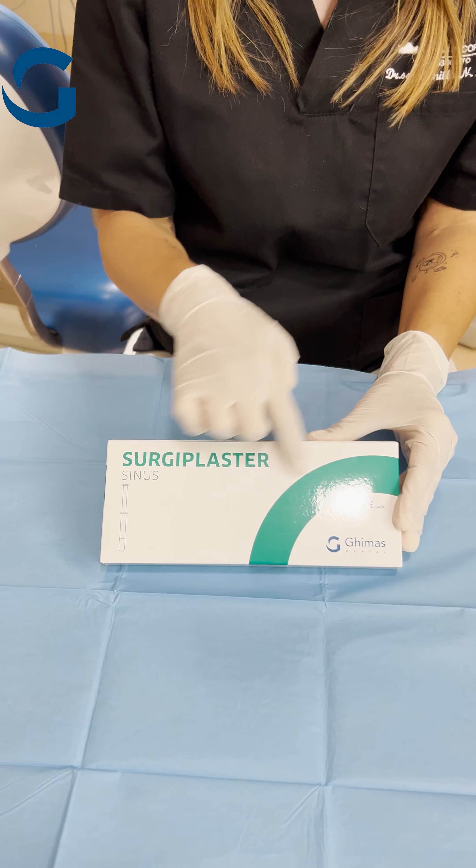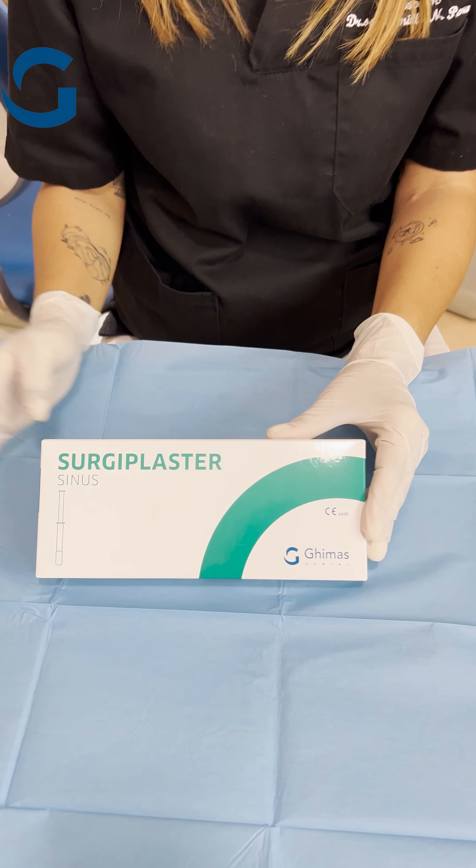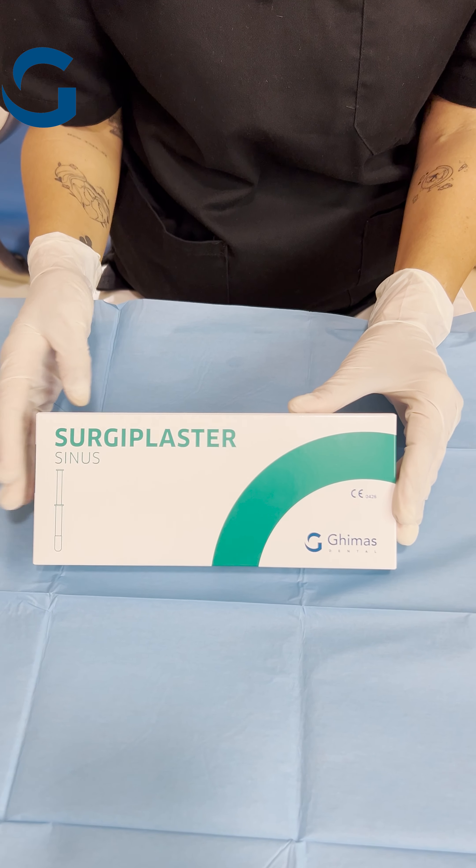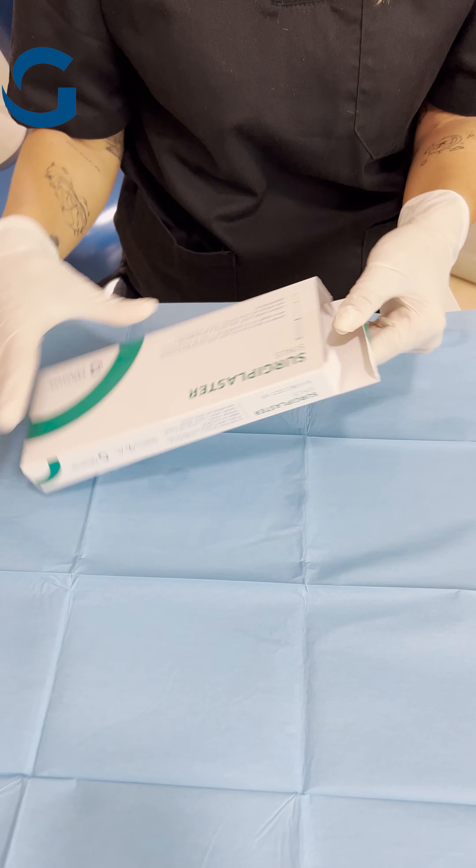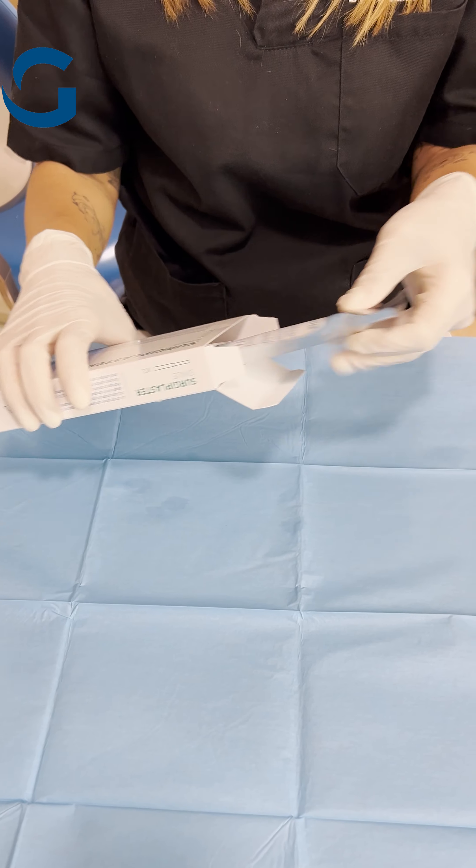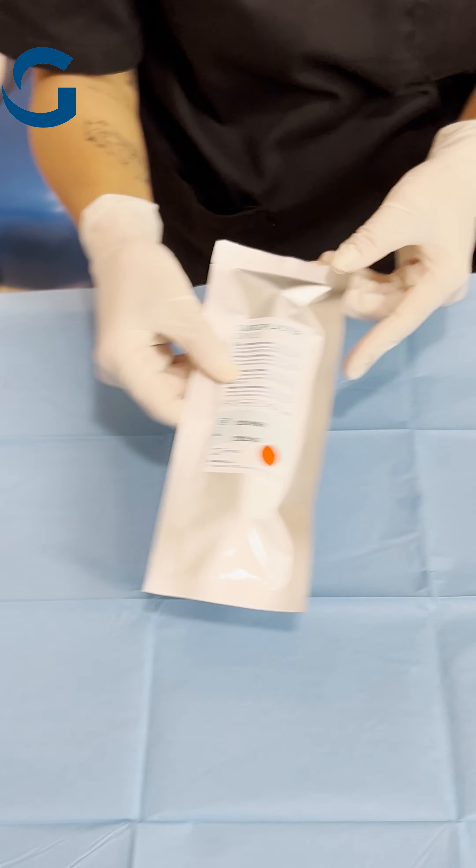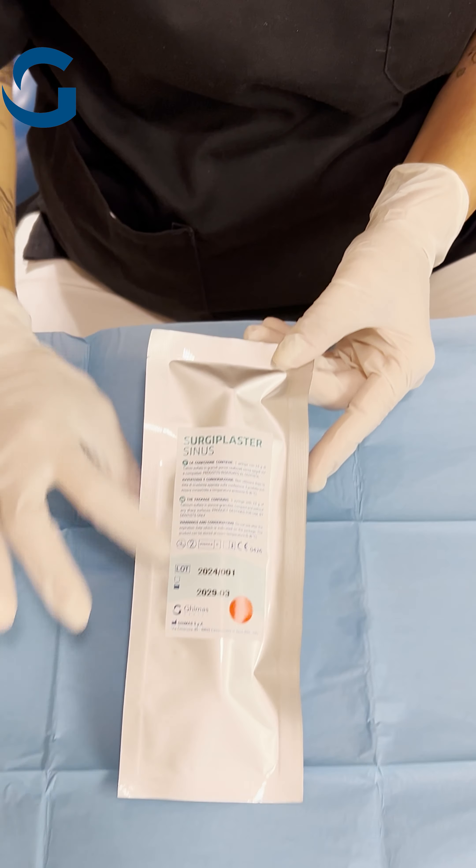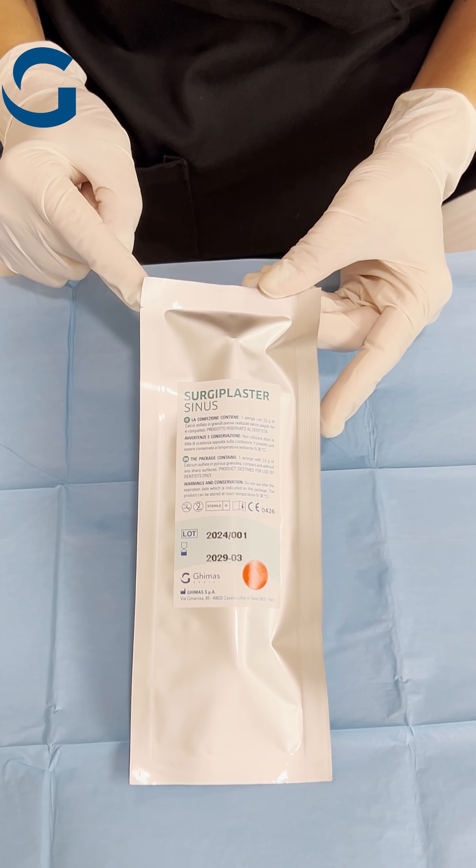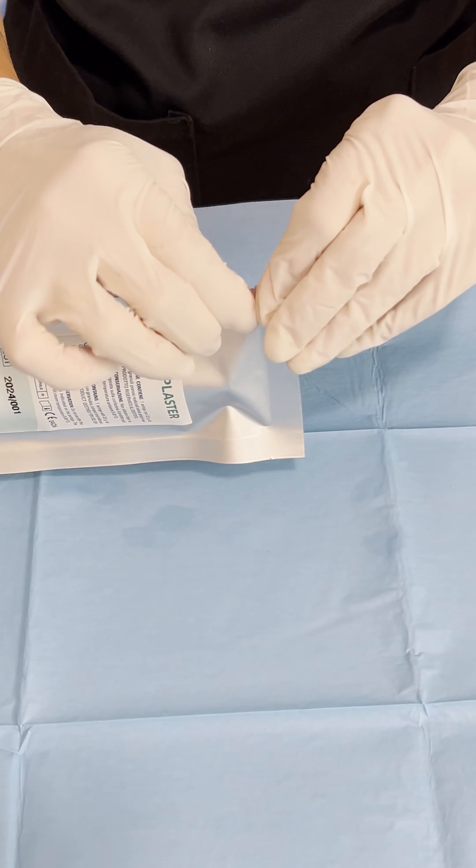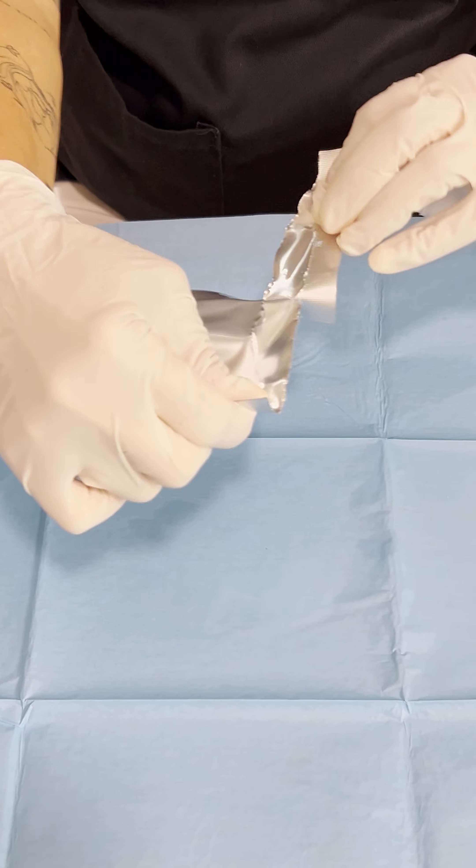As you can see, there's the color coding. In this case we have the green one so we can easily recognize them when we stock them. This is a slightly larger packaging, and it comes in the form of a syringe. You can open it from the sides where you can pull it out.